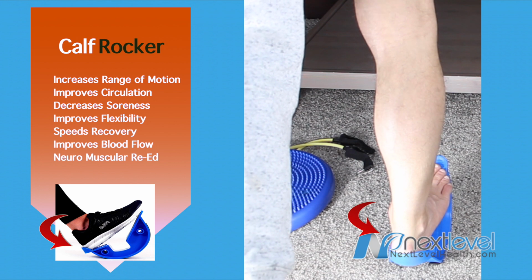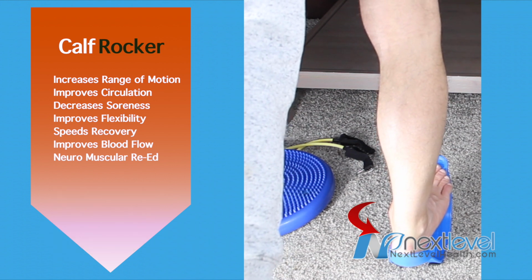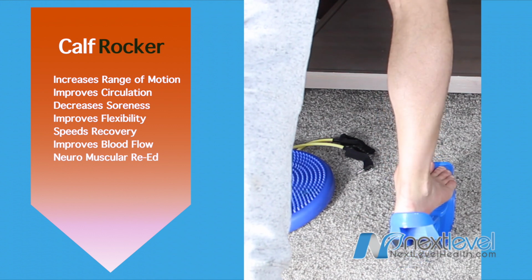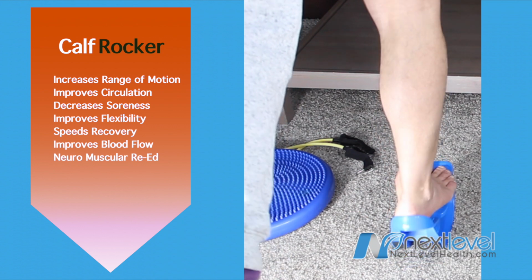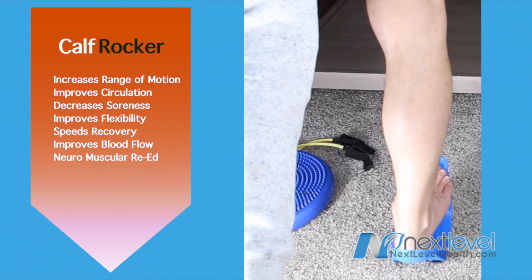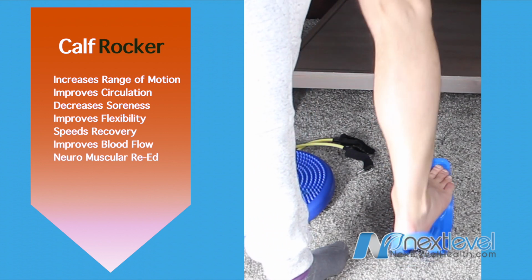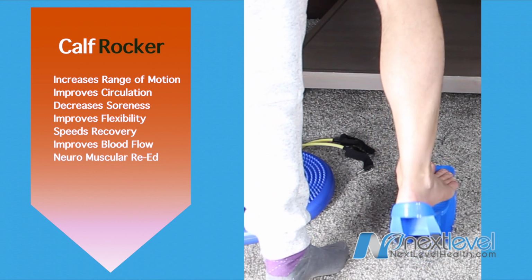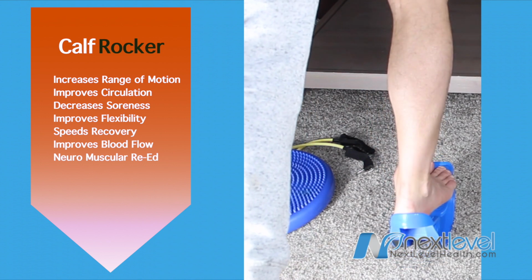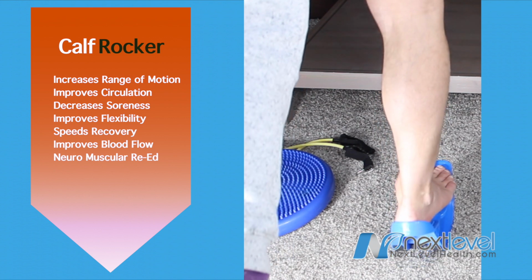So there's a number of different valuable reasons you're going to be doing this. Everything from neuromuscular re-education, stretching of your calf muscles, that plantar tendon, but also giving some circulatory help as well. Once again, simply take this out, place your heel on the back side of it, and then quite simply just continue to rock back and forth.